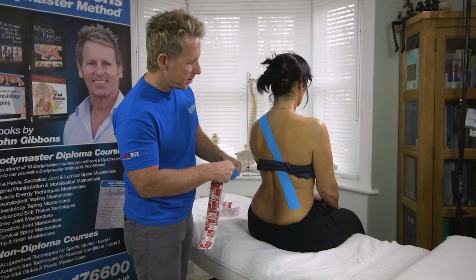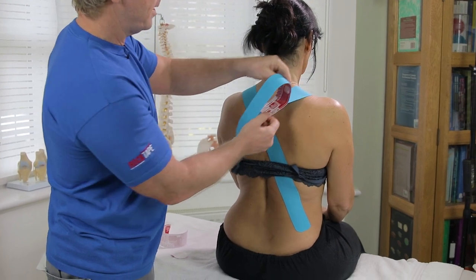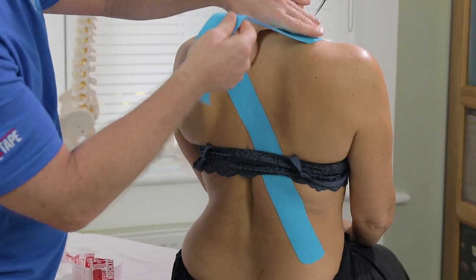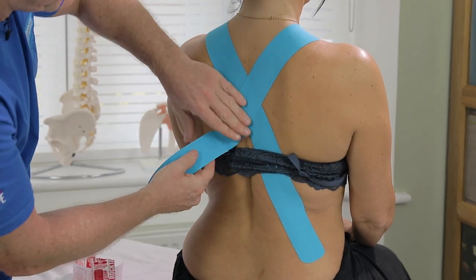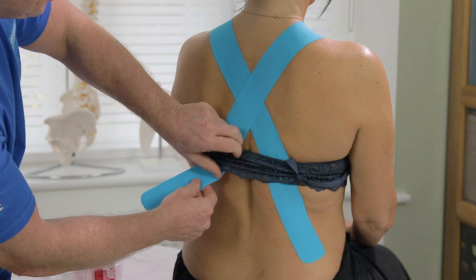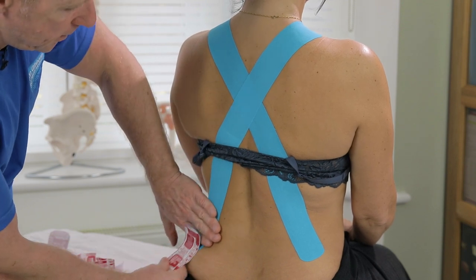The second one is going to go from the right side and I'm going to apply the tape here. For the demonstration you might find it realistic but if I just pull it halfway and rip that bit off — so we'll do the first part at 50% coming down. Where the bra strap is located for the lady, you might find it easier to keep the tape in contact and feed that under like so, and then lift that, peel back the tape, and again at 50% come down to that left corner here.